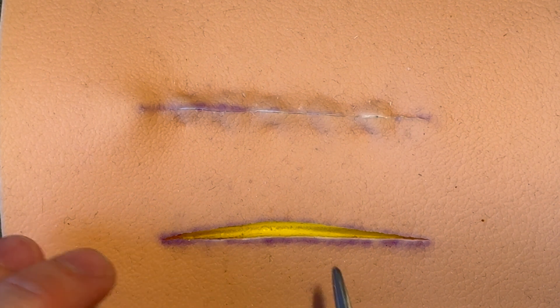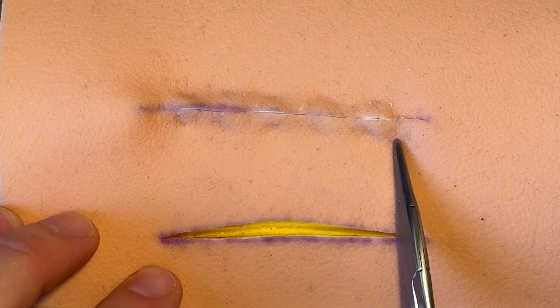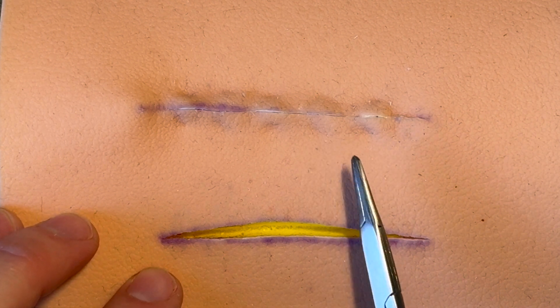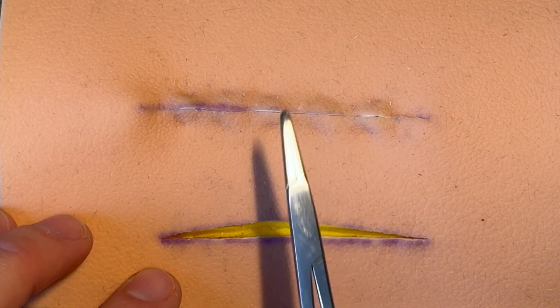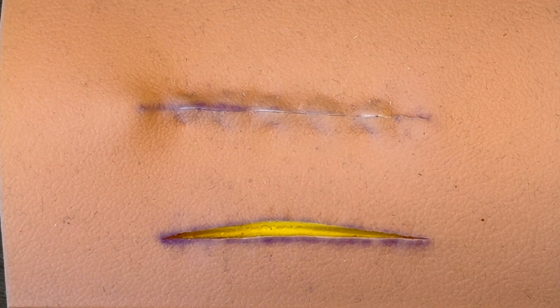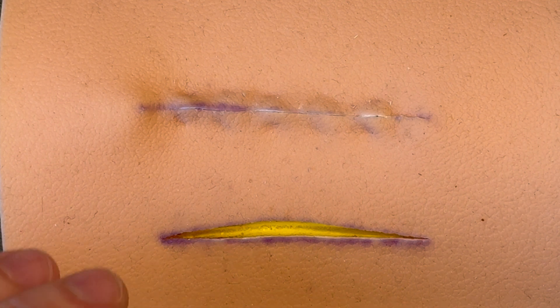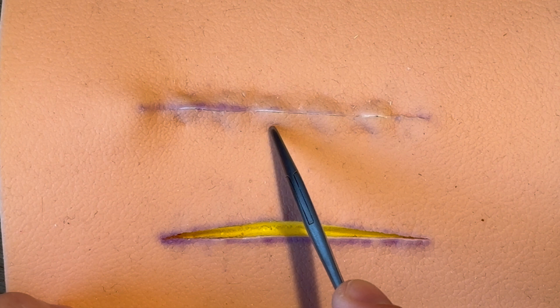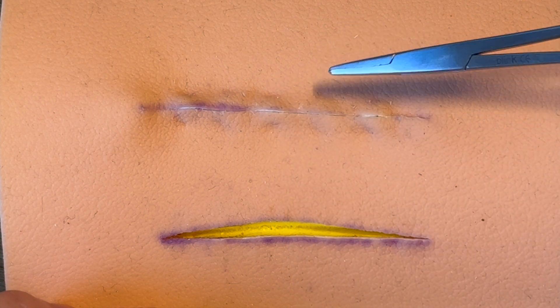Here I've got a pre-cut wound and a pre-stitched wound with the buried dermal sutures showing basically what you're trying to achieve — little bumps where the skin edge, the cut edge, is kind of pushed up. What we call this is everted, and that's because the skin is pulled together from either side.